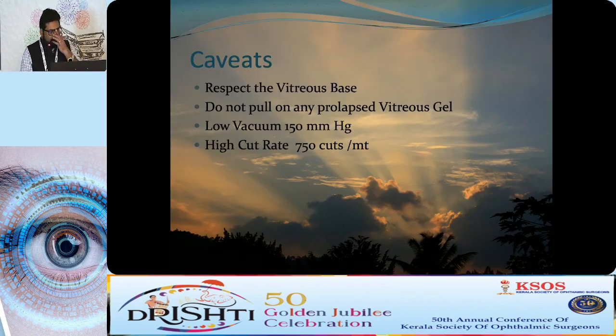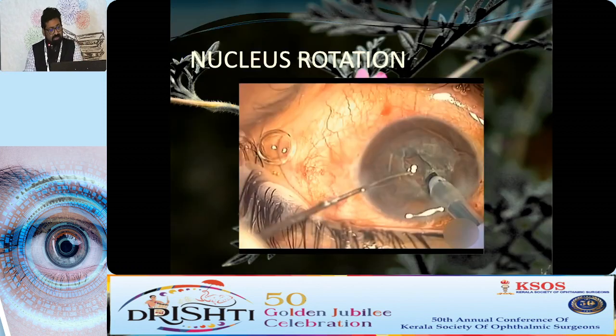And always respect, once you're doing a vitrectomy, do not pull, as this can cause traction on the vitreous base, and that can be disastrous. You always use a low vacuum and a high cut rate in these cases. So here, sometimes it can be a false alarm.